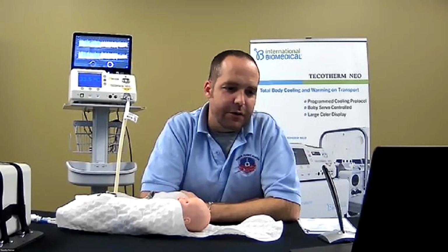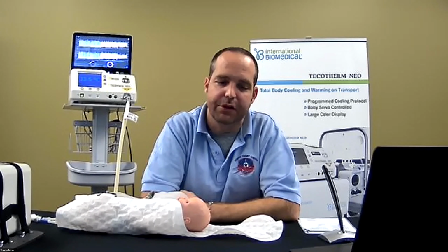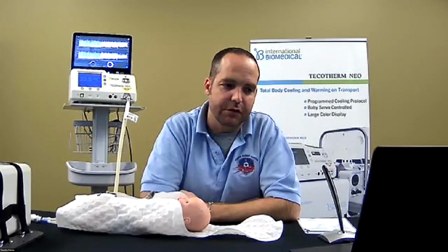To echo that, based off our passive cooling on transport, our set air temp is about 26. And then we really did stay away from adjuncts. I'm not saying we didn't always use them, but if we did, we cracked them, and we didn't make direct contact necessarily with the patient. We would use it to cool the air within the isolette. Depending on your resources, if you're trying to maintain that temperature for a long period of time, it's going to be about tracking and being really tight on your interventions. Absolutely.